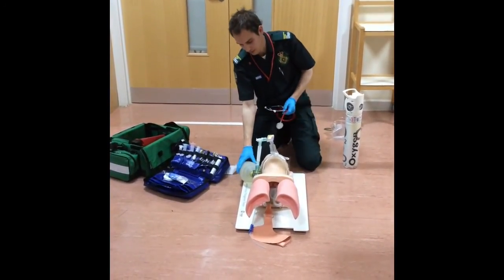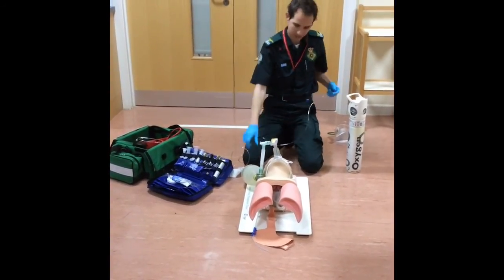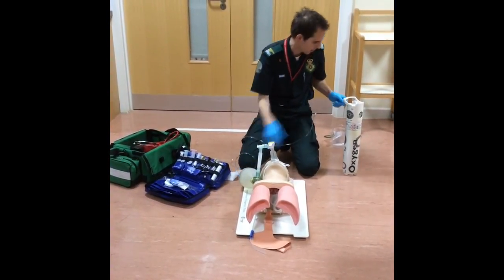Okay, and then I can reassess again if I want, and connect that back up to the oxygen.